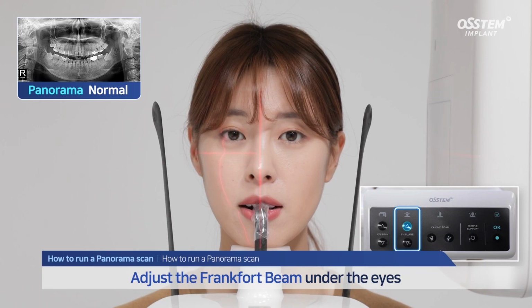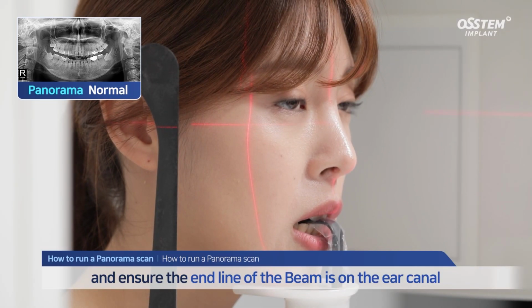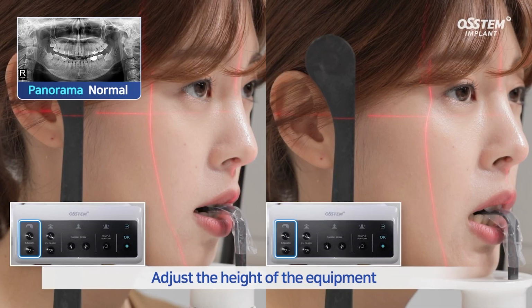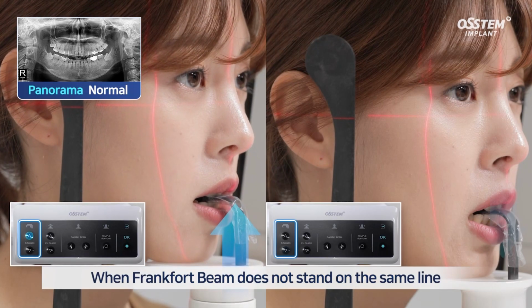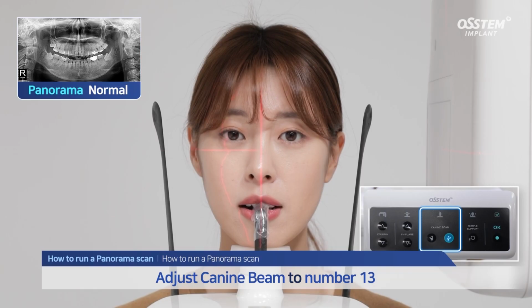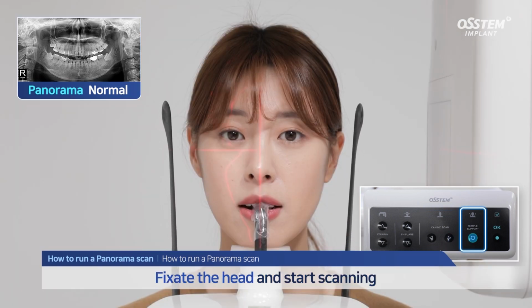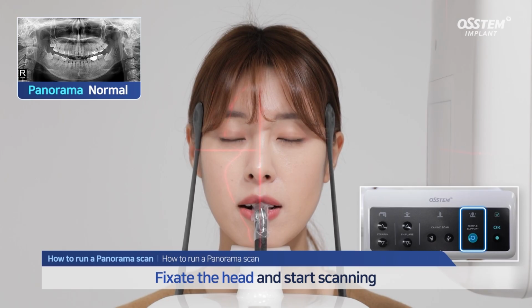Adjust the Frankfort beam under the eyes and ensure that the end line of the beam stands on the ear canal. If the Frankfort beam is not on the same line, press the column up or down buttons to adjust. Place the canine beam on the number 13 teeth. Press the temple support button to fixate the patient's head and then press the OK button to start scanning.